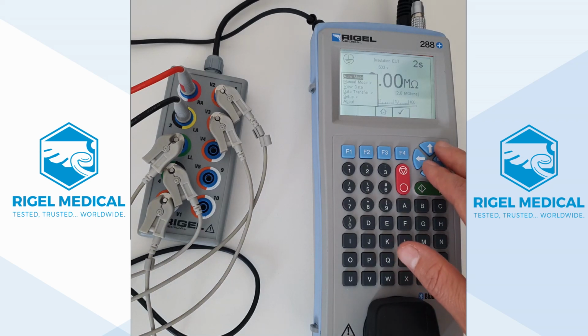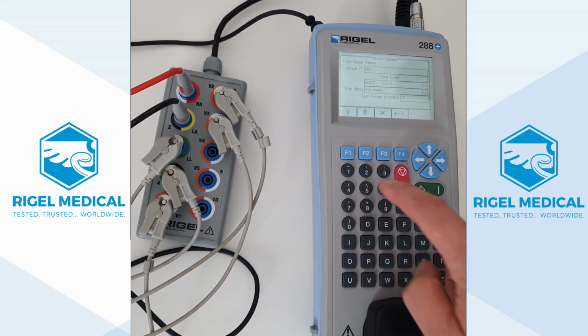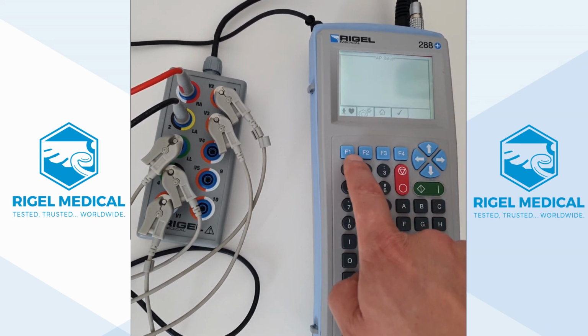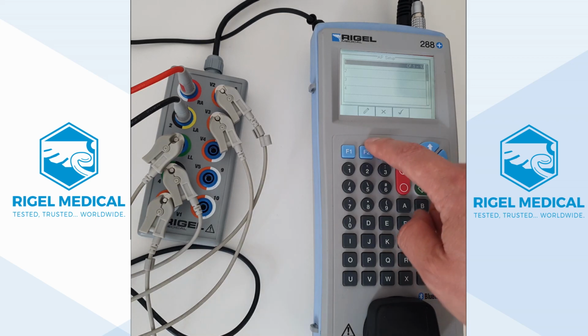So if we go to automatic mode, we'll key in an arbitrary number for our asset ID. We'll keep it for now as IEC 60601, class 1, and we'll go to applied parts, F1. Now automatically it's set up for the highest classification, CF, for all applied parts 1 to 10.